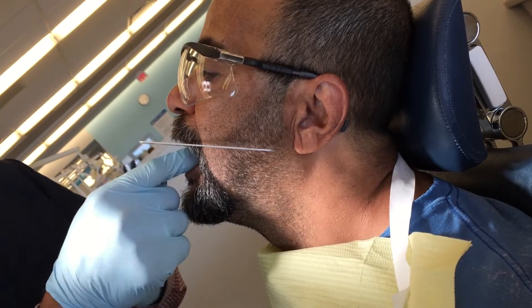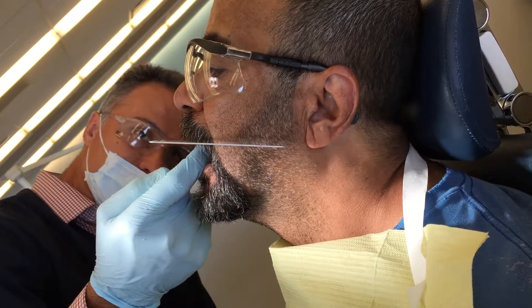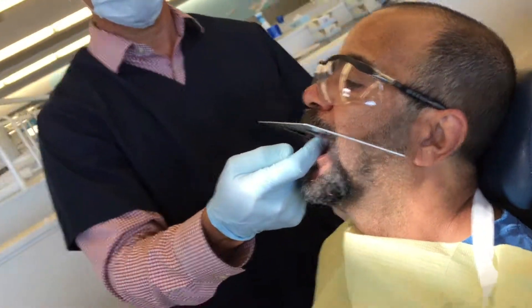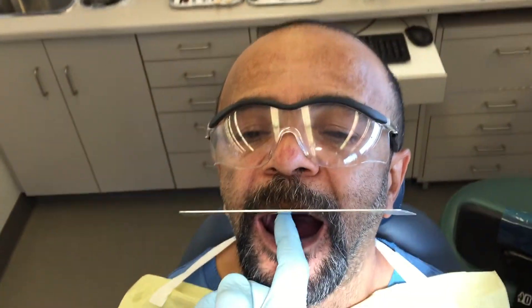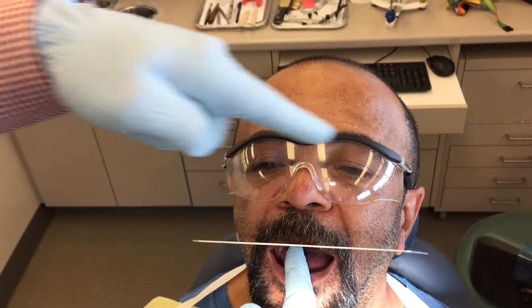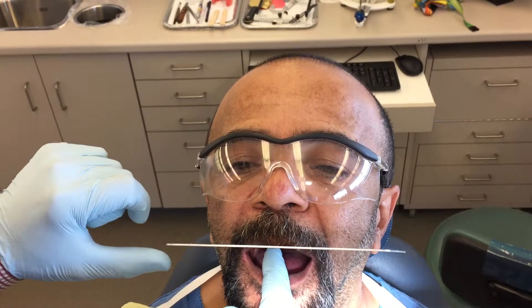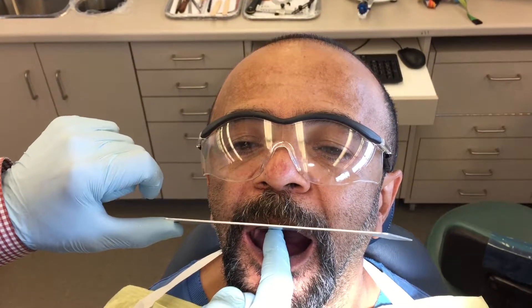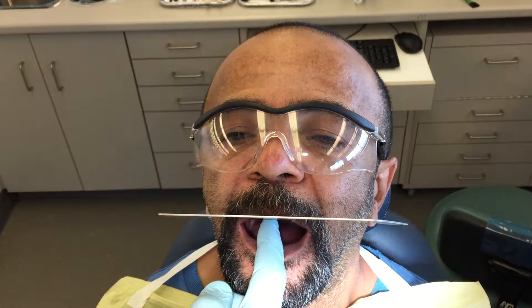I'm not sure if it is on that side. Tyler gives me a nod that it is. I can see it is on this side, but if we come from the front and look at the Foxplane from a left-to-right view, and visualize the Foxplane being parallel to the inter-pupil line — an imaginary line between the pupils — I think it's a little bit off. So I need to increase the vertical a little bit more on the patient's left side.